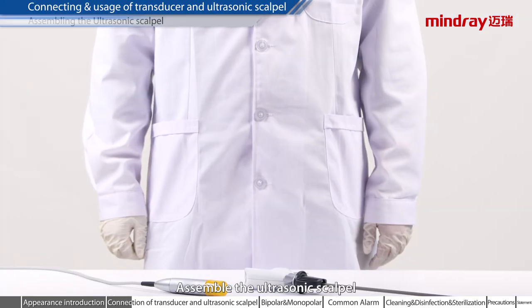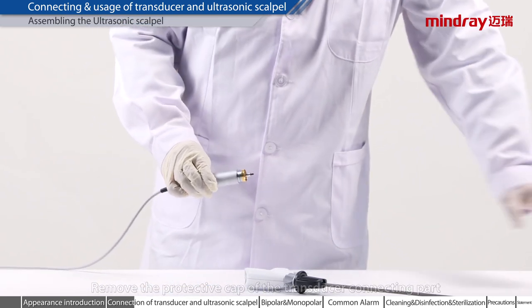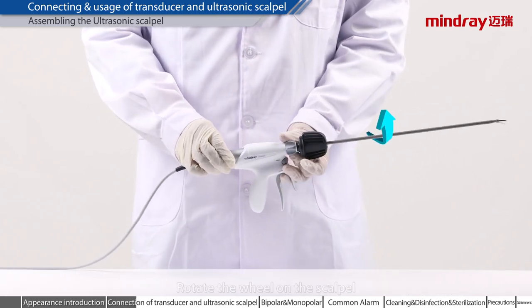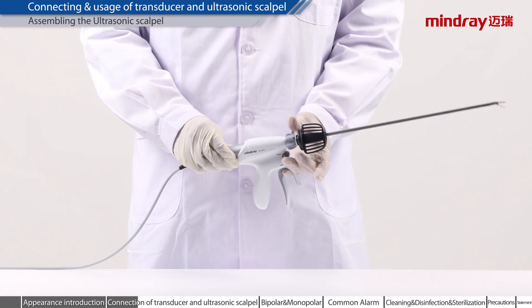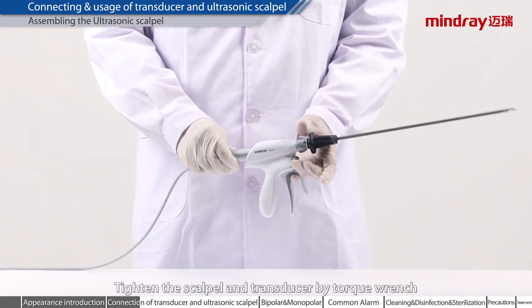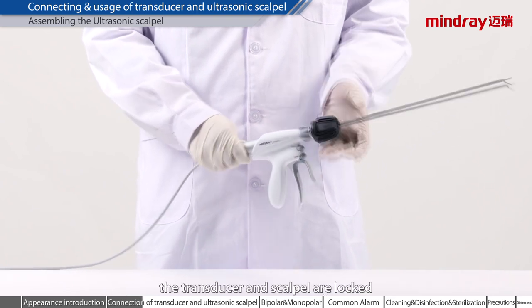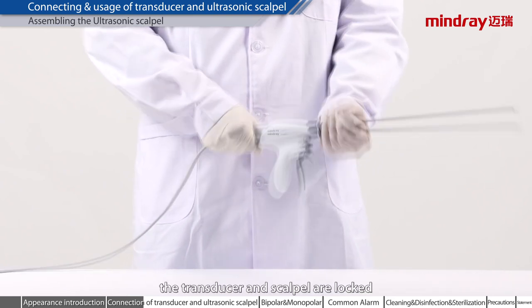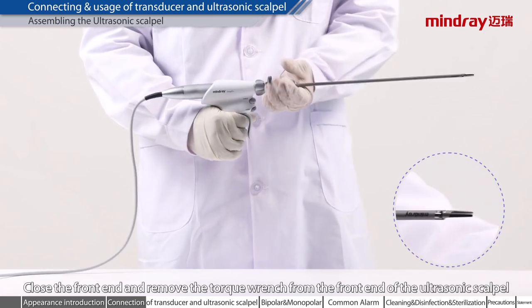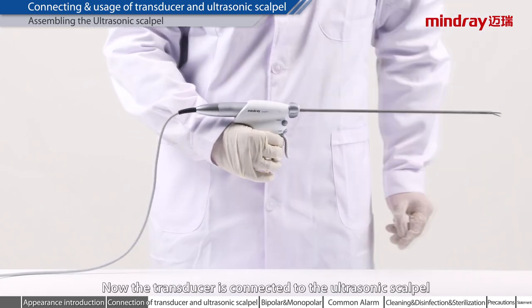Assembling the ultrasonic scalpel. Remove the protective cap of the transducer connecting part. Connect the transducer connection part with the scalpel. Rotate the wheel on the scalpel. Tighten the scalpel and transducer by torque wrench. After two clicks, the transducer and scalpel are locked. Close the front end and remove the torque wrench. Now the transducer is connected to the ultrasonic scalpel.